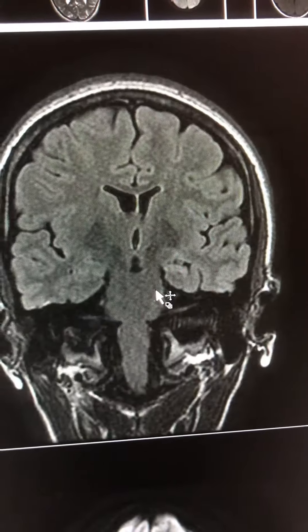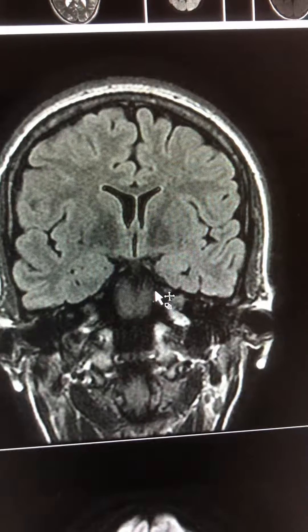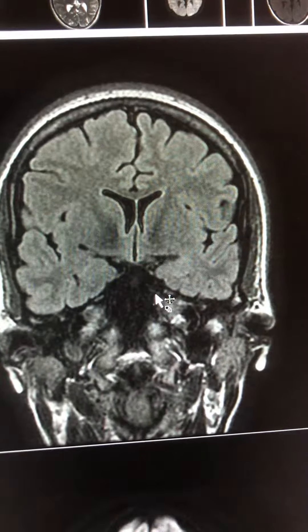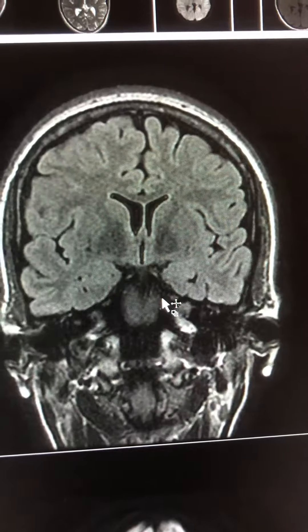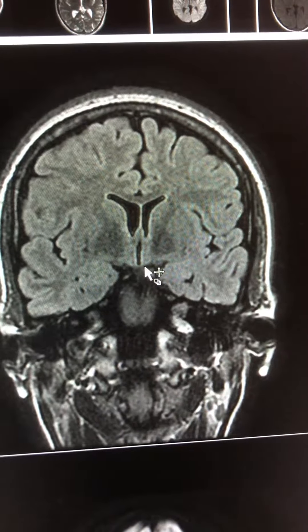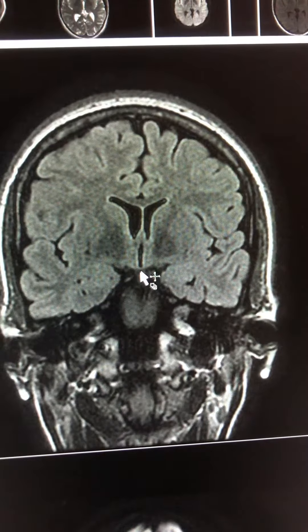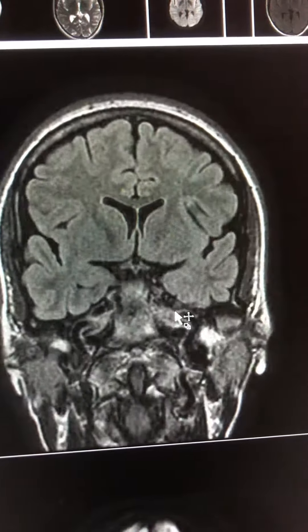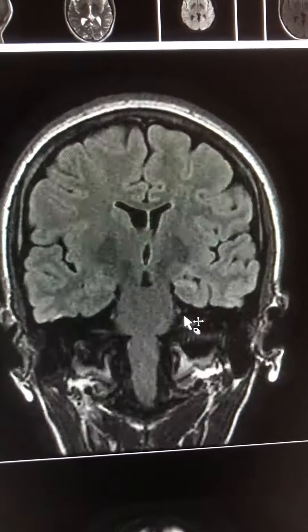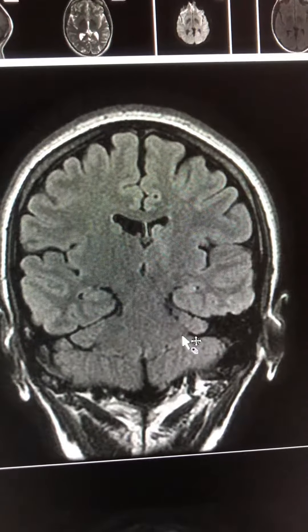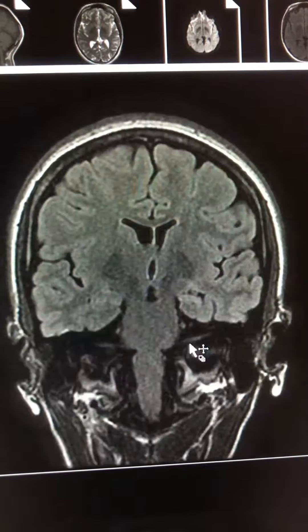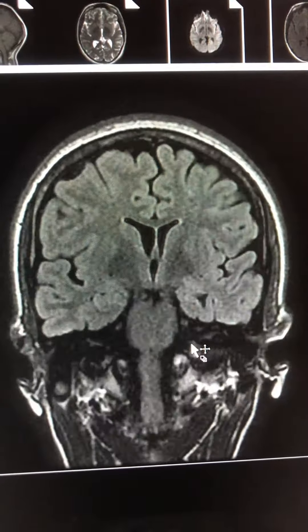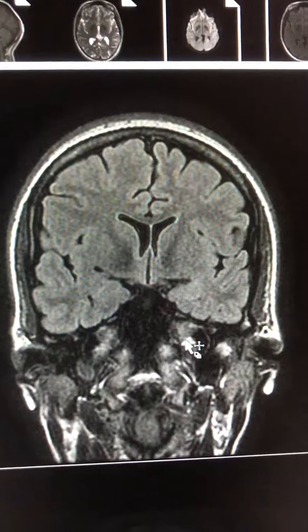The mammillary bodies sometimes also show some asymmetric atrophy, and in this case you can see some flattening on the left compared to the right. So this is a typical finding of mesiotemporal sclerosis — a classic case.